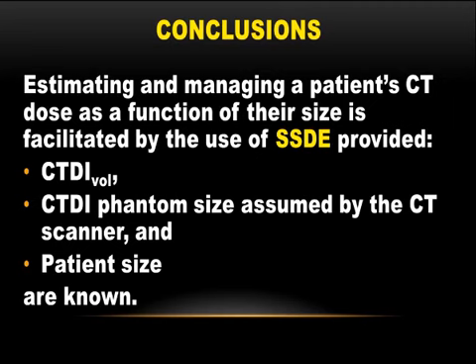Keith, you pointed out that the CTDI vol is the average over the length of the scanned patient, and that diameter is crucial to the SSDE. Where do you choose to define the diameter of that patient, which is not a cylinder? That's a great question, and I think in some ways it's got a practical answer.